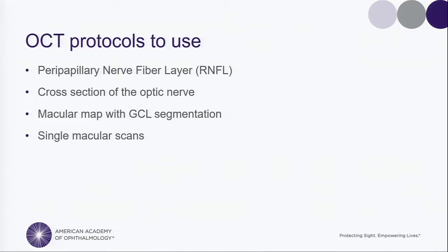So I'm going to be talking about OCT because that's what I've been assigned to do. And OCT is very versatile. There are multiple protocols we can do. A lot of times, most people will think, oh, OCT of the optic nerve, we just obtain the retinal nerve fiber layer, and that's where we stop. But actually, when I get an OCT, I look at multiple protocols.